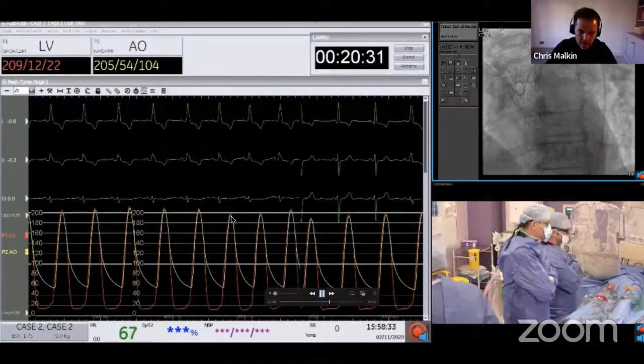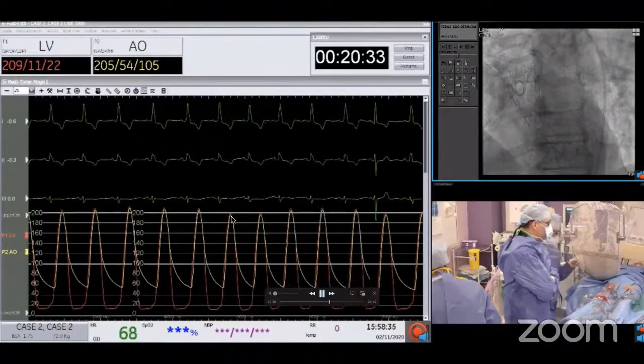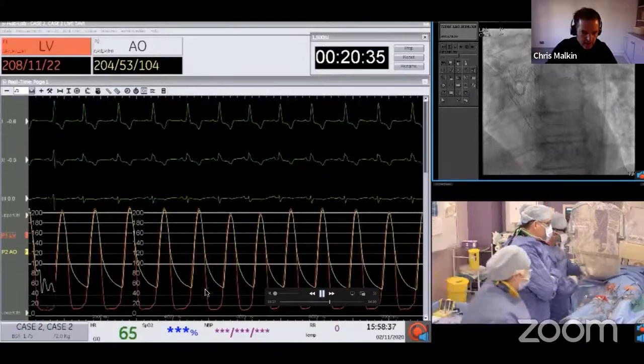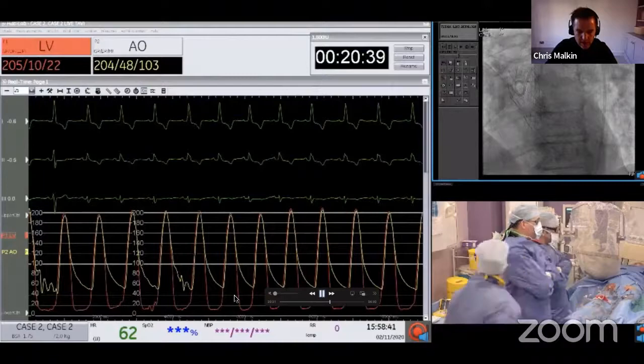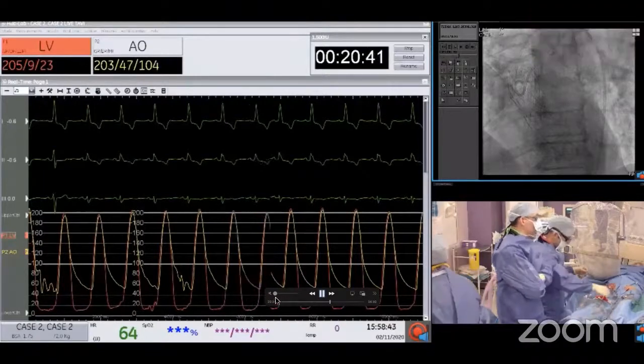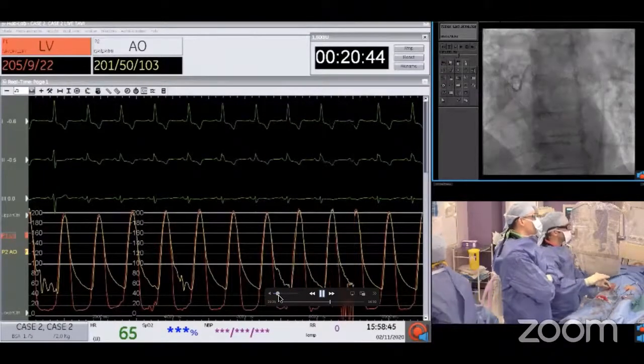The gradient is gone. There's possibly a very tiny peak-to-peak gradient, but the LVEDP is still low. Aortic diastolic is good. The patient's still hypertensive, but that looks pretty good. So I'm going to do a pullback now.